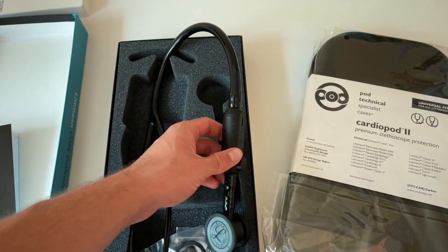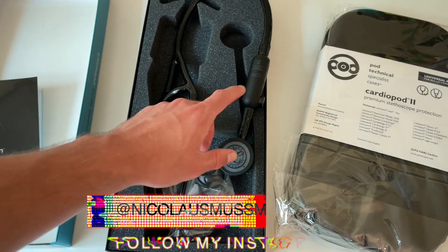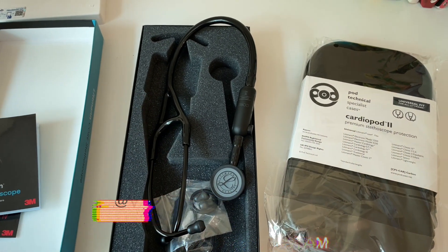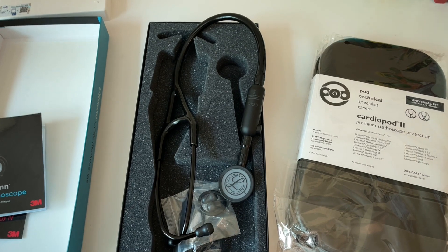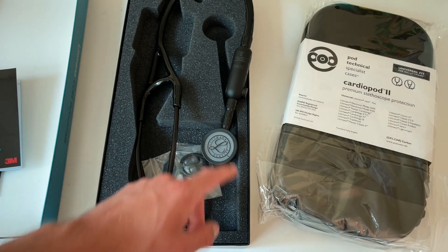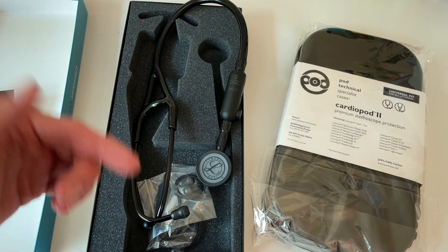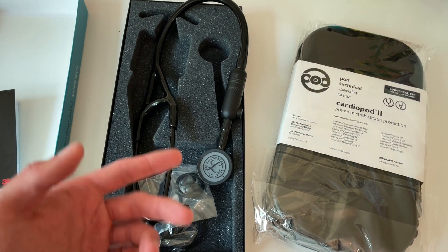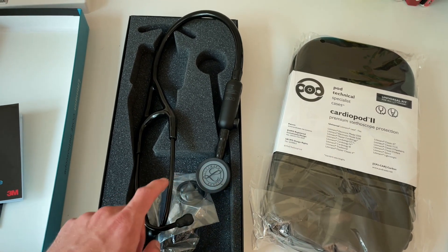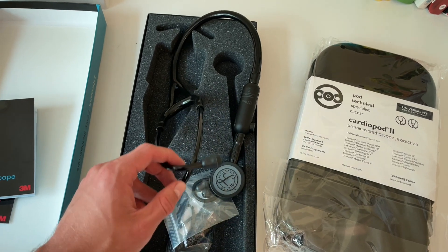So you can increase the volume, you can also decrease the volume, you have some type of noise cancellation, and at the same time you can also record heart sounds. For example, if I hear mitral stenosis I can record this, then put it onto my phone and re-listen again. I can also use this to practice heart sounds I've never heard before — I can just put them on this and it will give me the exact sounds.